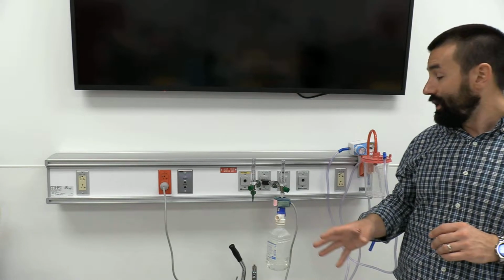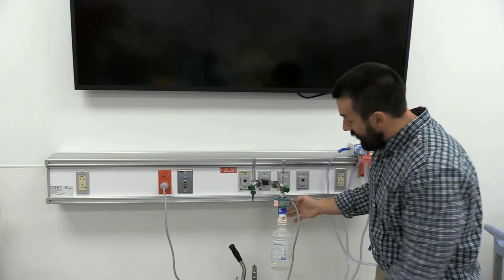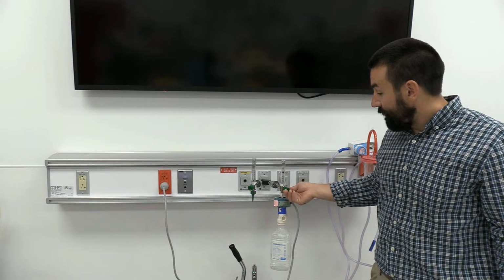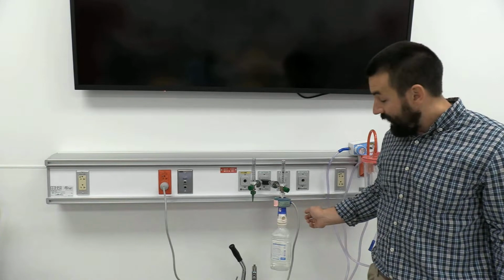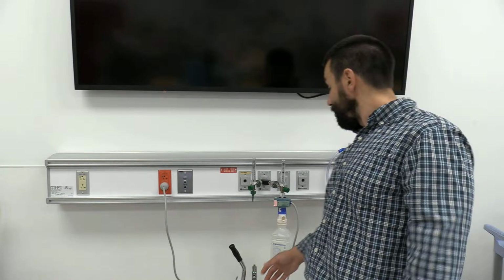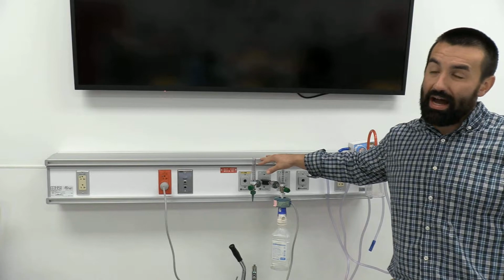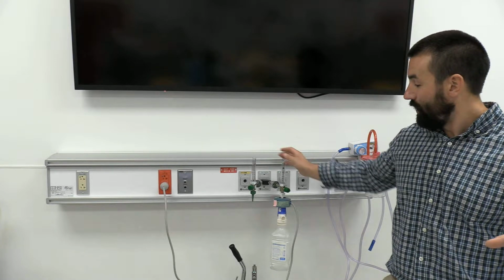We'll also talk about some issues in regards to being able to get enough total flow on these higher FiO2s, okay? Now remember, these are back pressure compensated flow meters, so if I had to go up to 40% FiO2, I'm just turning my bottle here, we know my entrainment ratio changes. So now I have a 3-to-1 ratio, 4 parts. I've got to set this at 15 liters a minute. Because there's so much back pressure, especially here where I'm not truly having the same sophistication of a constant 50 PSI gas source like I would at a hospital, I can't get above 10 liters a minute. So I've got to be able to figure out how much total flow is coming out of this device.